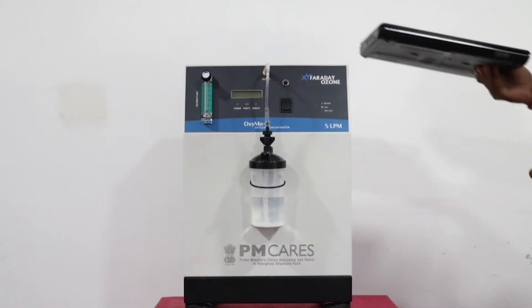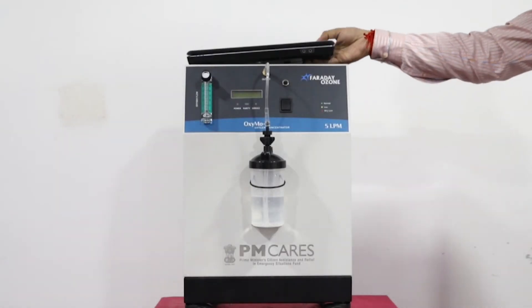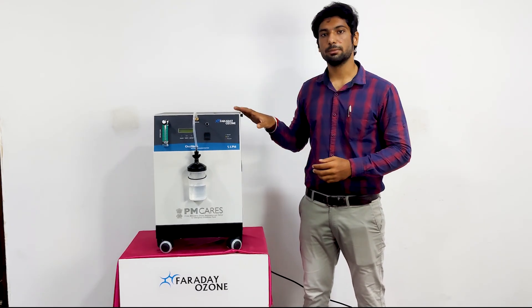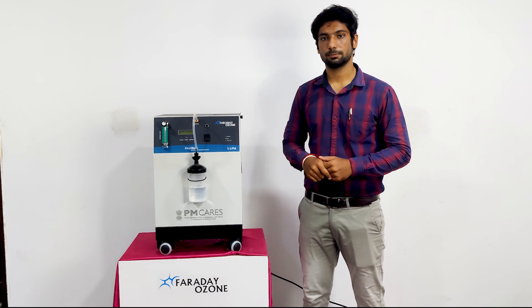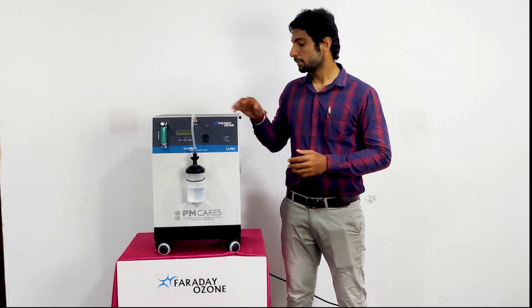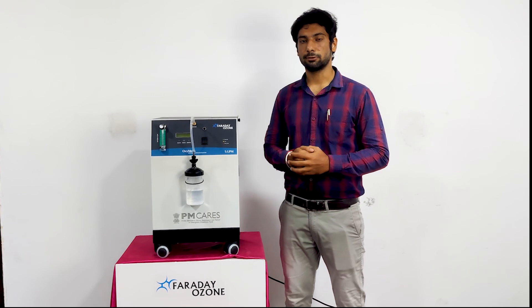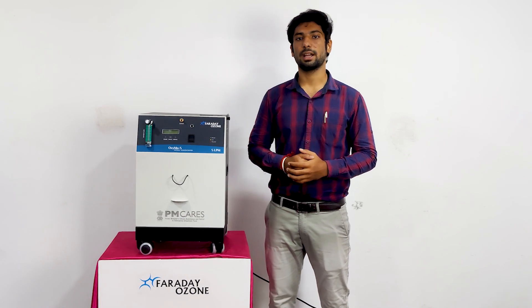Do not place any items on top of this oxygen concentrator, and do not attempt to clean the device when the machine is powered up. The oxygen generated by this machine is supplemental and should not be considered life support or life sustaining. I hope this video helps you understand the operation and maintenance of this oxygen concentrator. For any queries or assistance, contact us. Thank you.